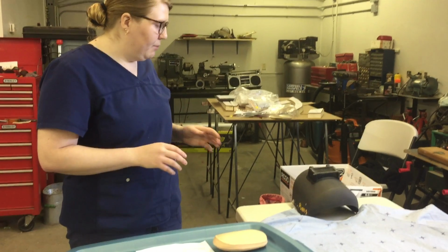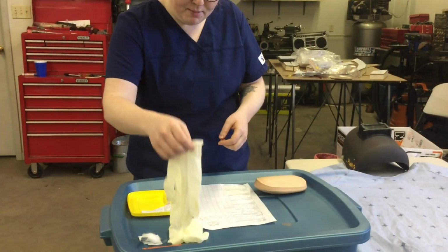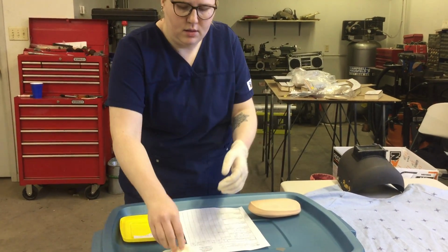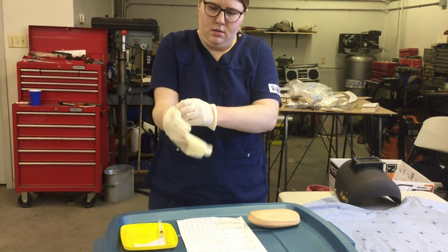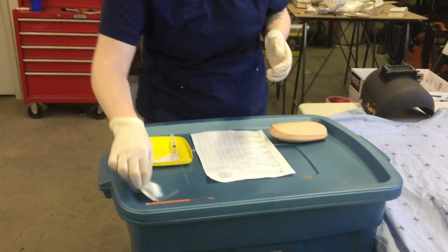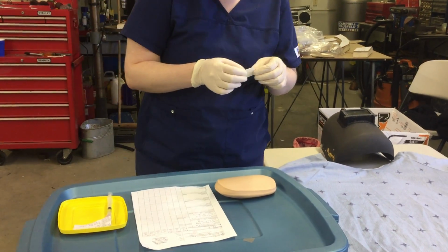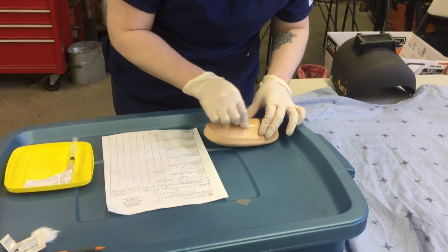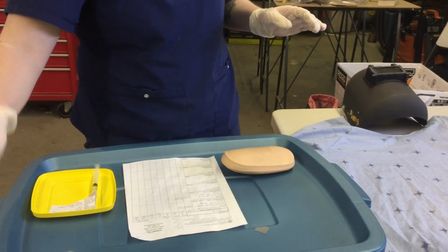After I've done that, I'm going to wash my hands and apply my clean gloves. Okay, after I've applied my clean gloves, I'm going to get my alcohol swab. I'm going to open it, take it out, and clean where I've landmarked in a circular motion on the patient's skin for 30 seconds. For demo purposes, I'm going to take that 30 seconds. I'm going to let the spot dry. I'm going to throw that in the garbage.